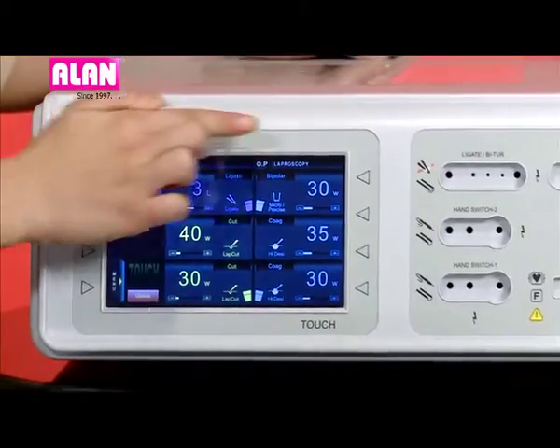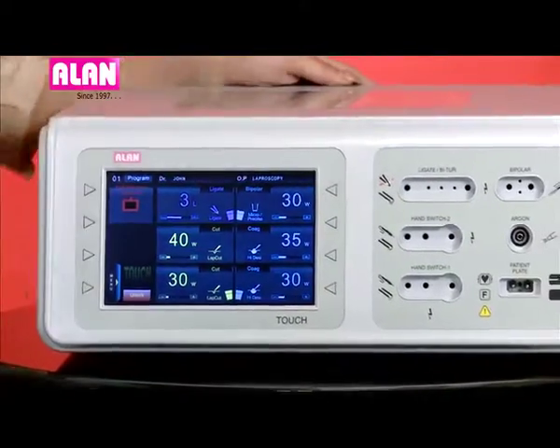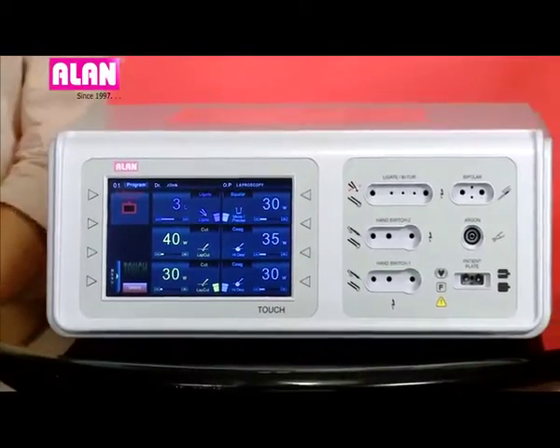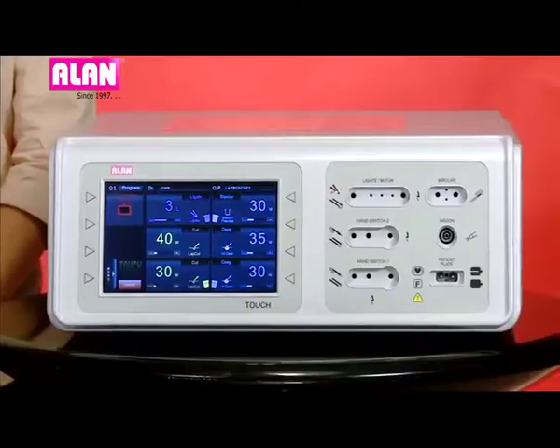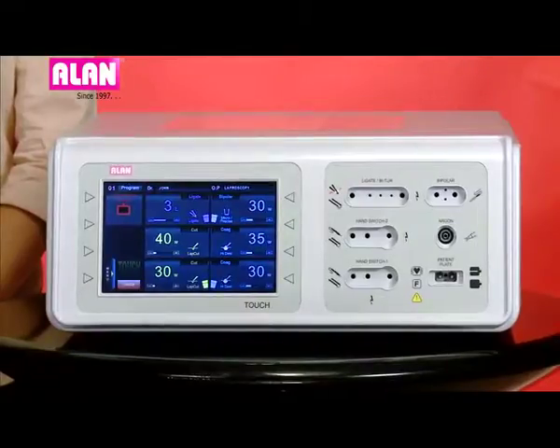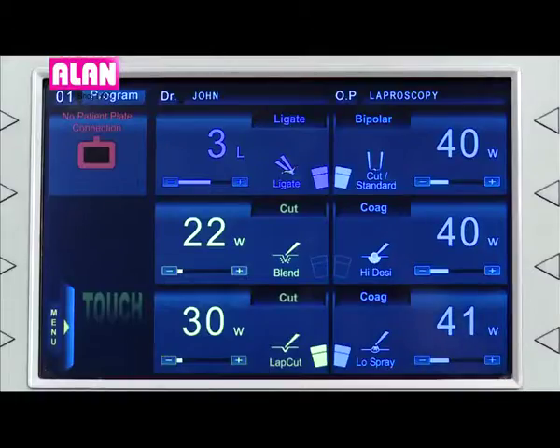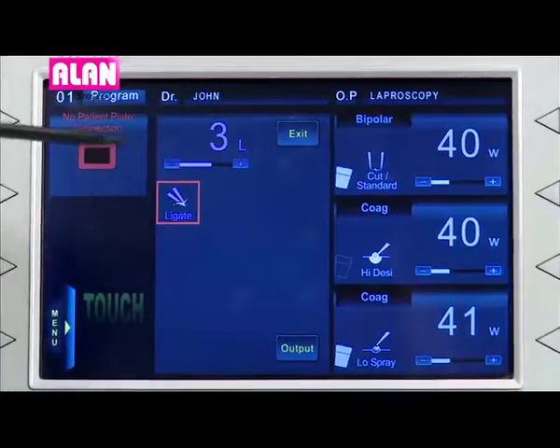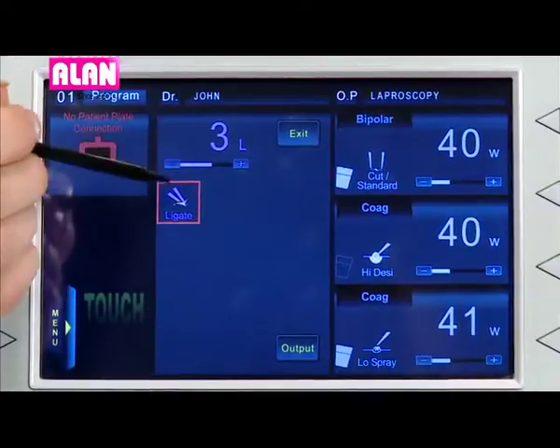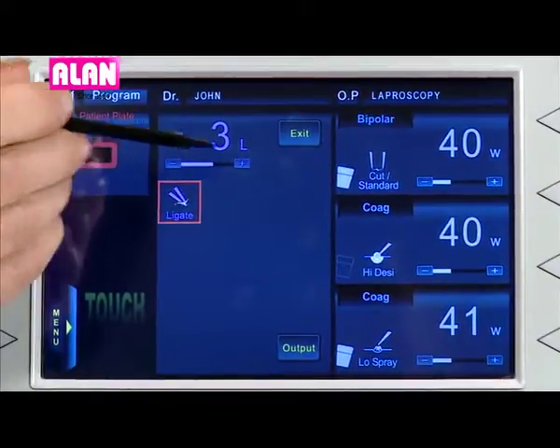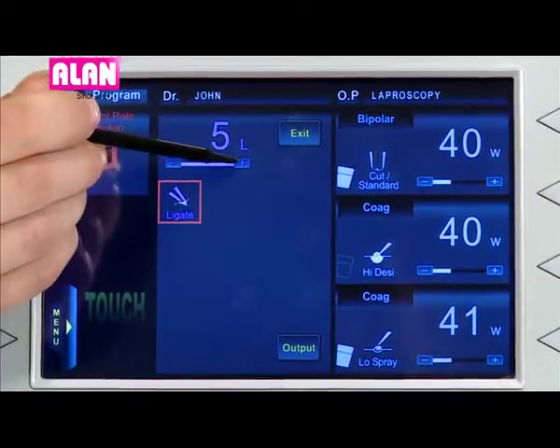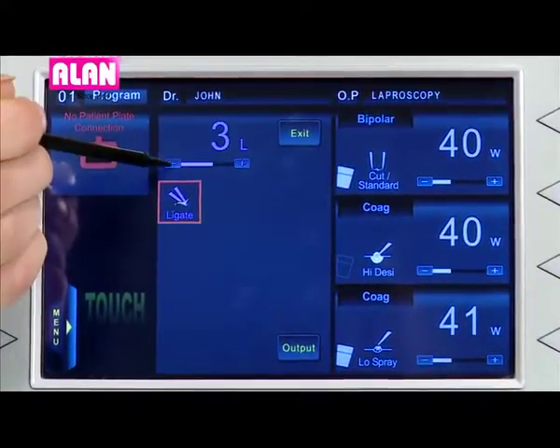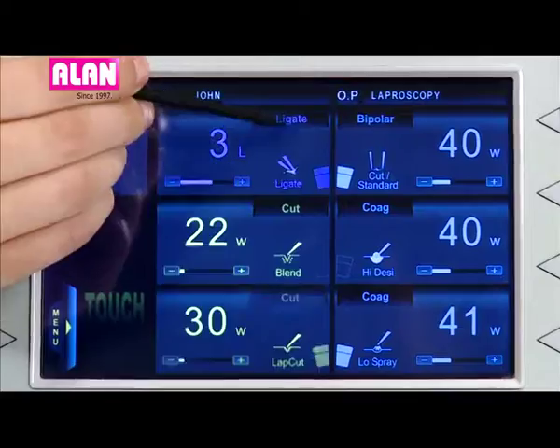Each window shows the currently selected power mode and footswitch selections. To change the power level and mode, touch the mode icon, select the desired mode, and select the desired power level.